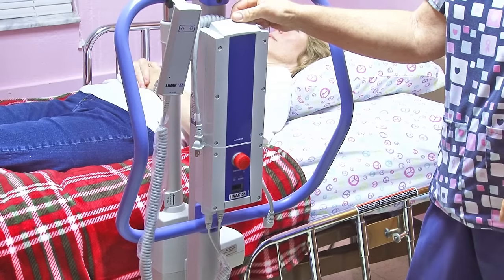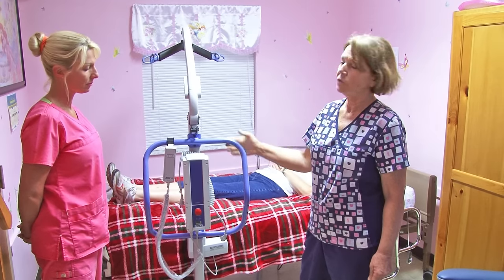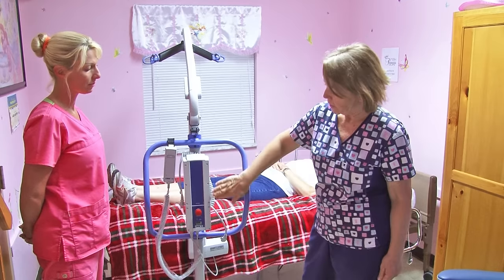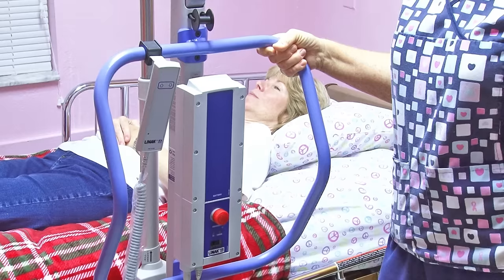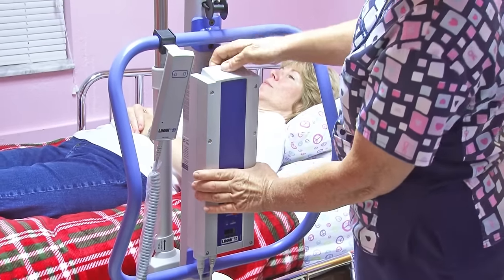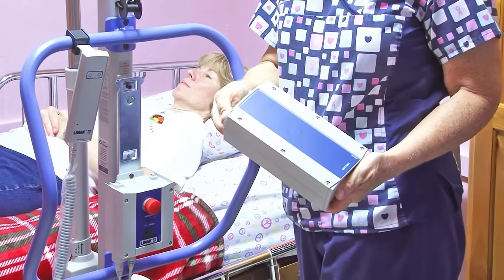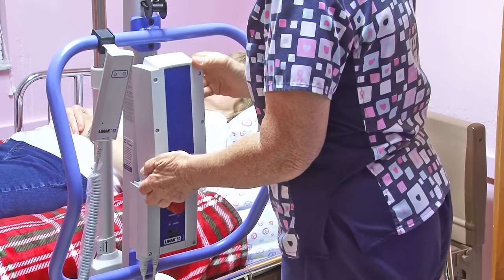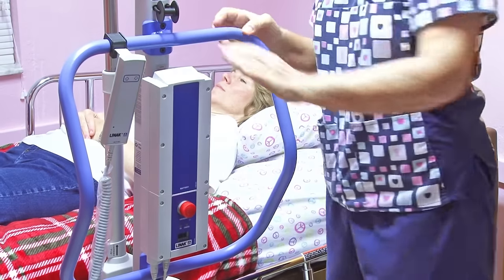The battery pack is all the power, and that gets charged when it's going to be sitting. You're also going to make sure that the sling is not frayed, and that the battery shows four bars indicating a full charge. To remove the battery pack, place your hand down here to stabilize it, lift up, and that is the whole battery pack. To place it back in, line up the little metal piece, put it lower, and you can hear that it's clicked in.